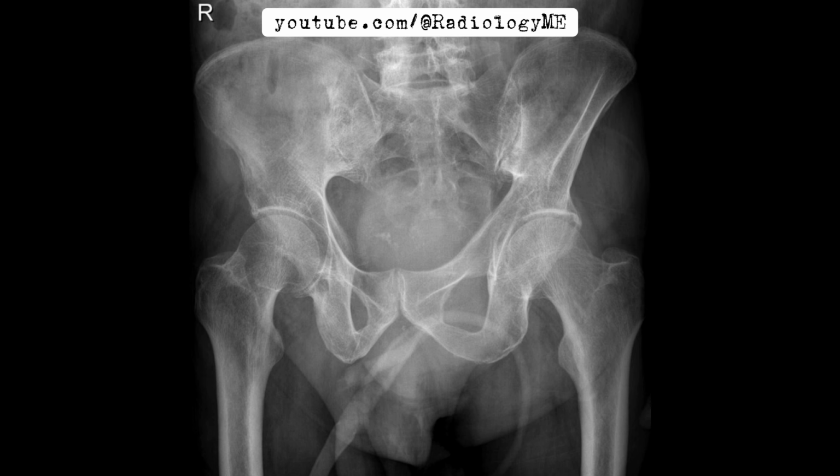The pelvis AP film brings our focus right to a soft tissue density over the distal sacrum. The more you look at it, the more you start to realize that something isn't right. There's clear bony destruction here, not a subtle finding. The lesion itself extends inferiorly, dipping below the level of the pubic rami. Already, this suggests something pretty aggressive and destructive, and your differential list starts taking shape.